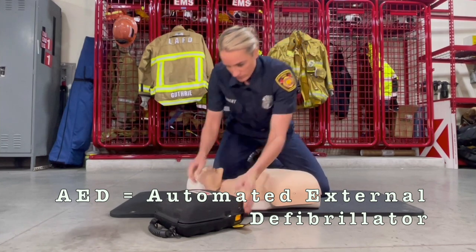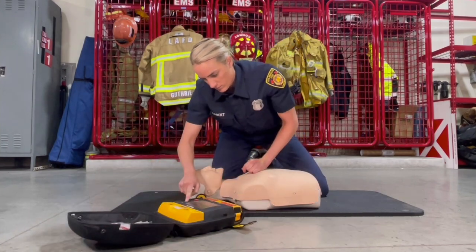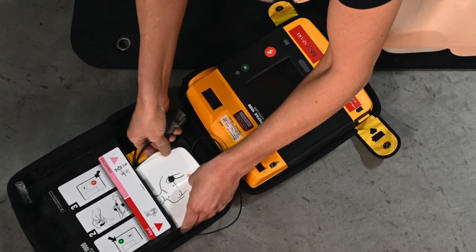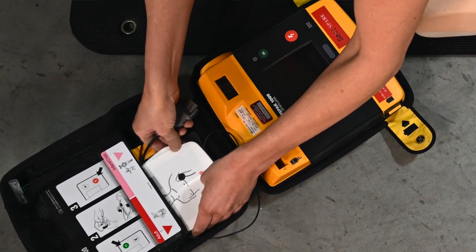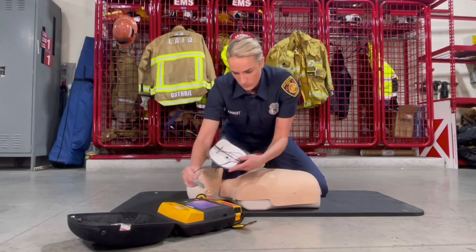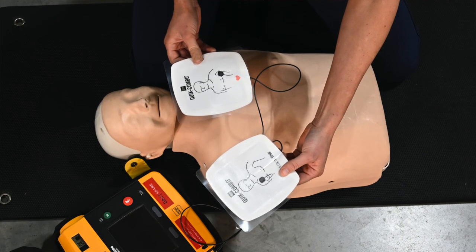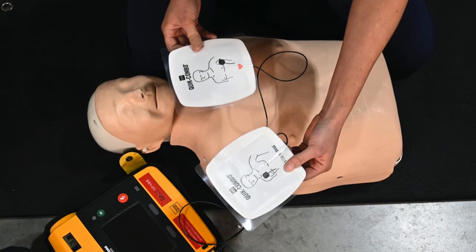As soon as the AED is available, turn it on and follow the prompts. Place the pads like the pictures show.